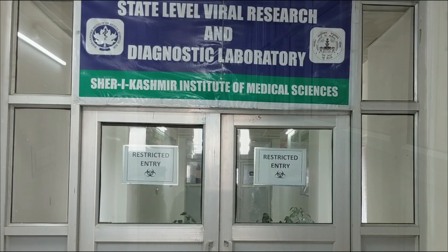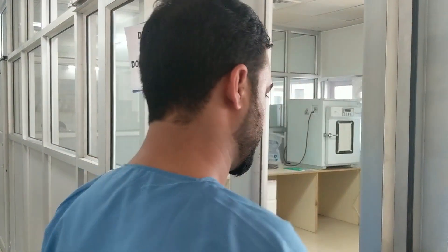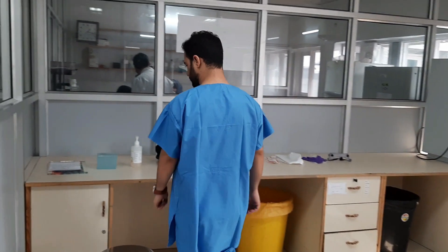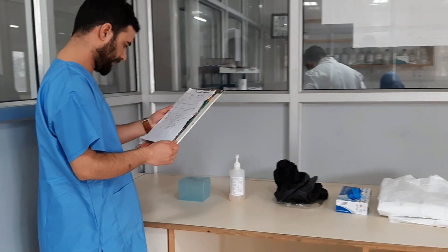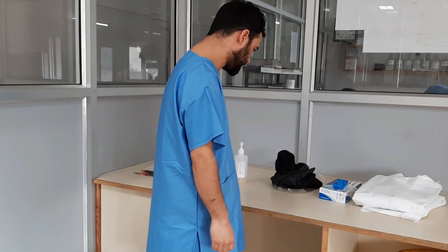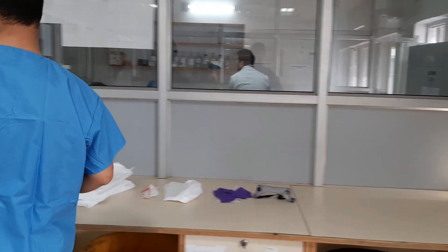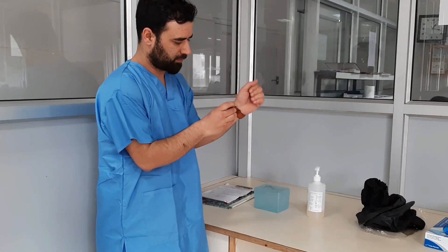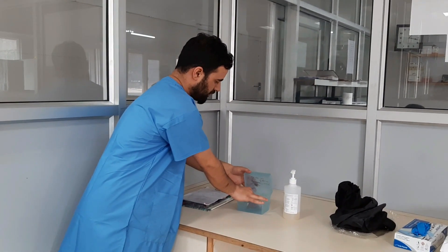Before donning your PPEs, change into the surgical scrubs and shoes. Ensure that you have a checklist of necessary requirements for PPEs and arrange them as shown in the video. No personal items like cell phones, pens, jewelry, or watches should be brought while doing sample collection or in the patient's room.